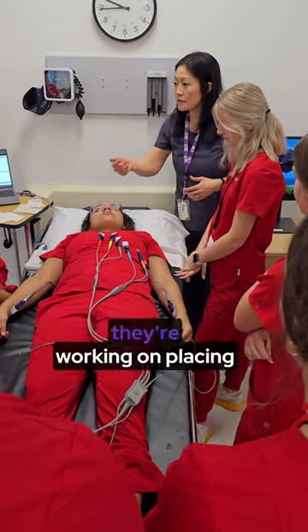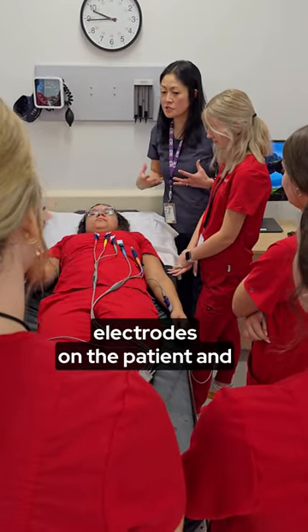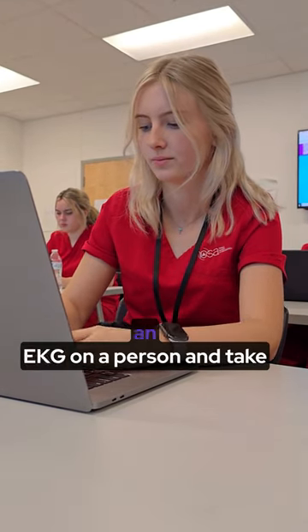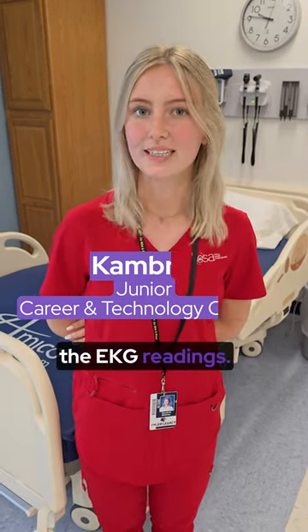Right now they're working on placing electrodes on the patient and running the EKG, so they can run it on their own and be ready for the certification. We're demonstrating how to put an EKG on a person and take the EKG readings.